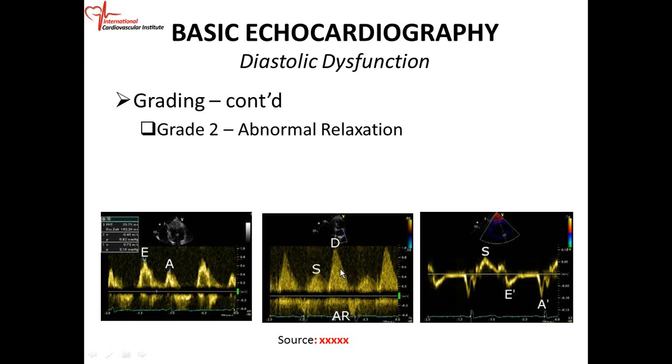If we look at our pulmonary vein flow in systole, which is from the beginning of the QRS to the end of the T wave, we have our systolic component, then we have our diastolic component, and our atrial reversal. You see the systolic component is less than the diastolic component. So right away you think, it's just not really normal.